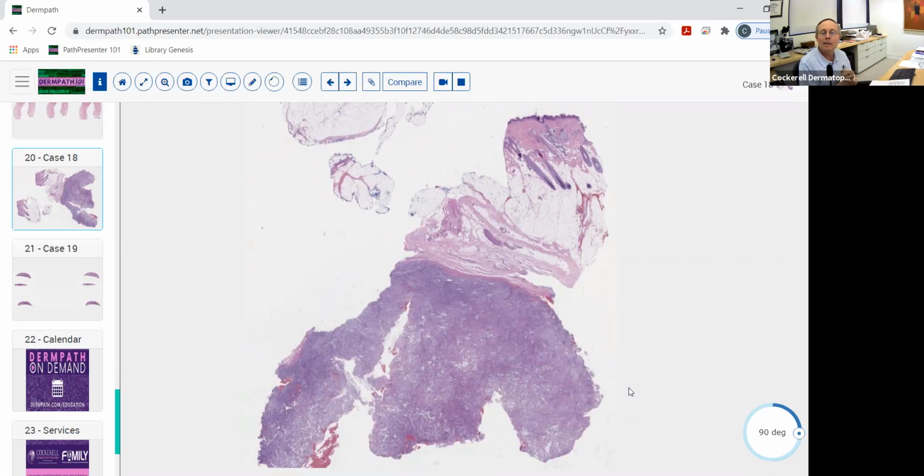You've got to take something like a knife and fork, a scalpel biopsy, and try to cut out this entire thing. And they probably thought this was a cancer. So that's why they cut it out. And you can see that even though it's deep, it's pretty big, but it's not giant. And it is well circumscribed, and it is very symmetrical.